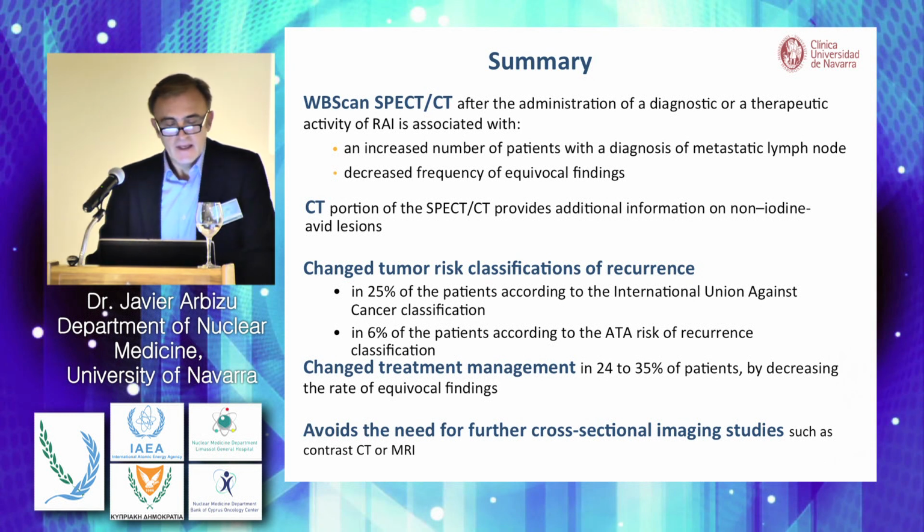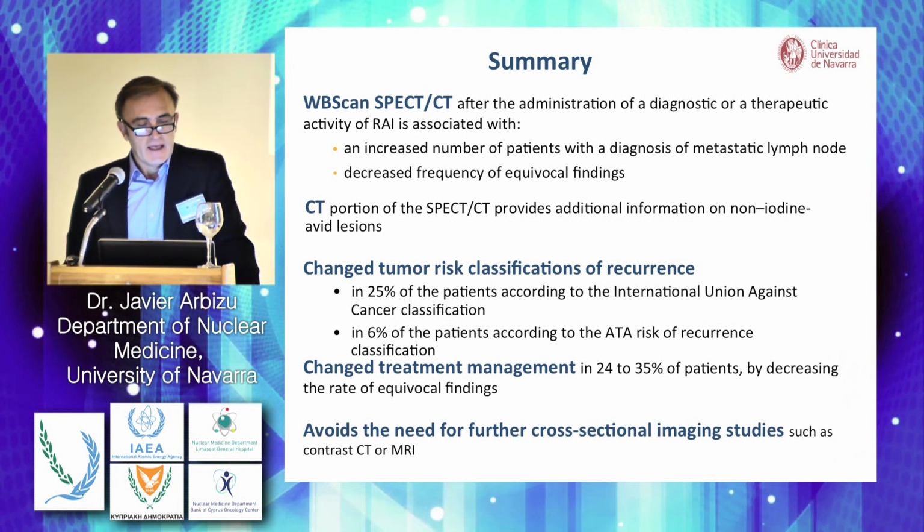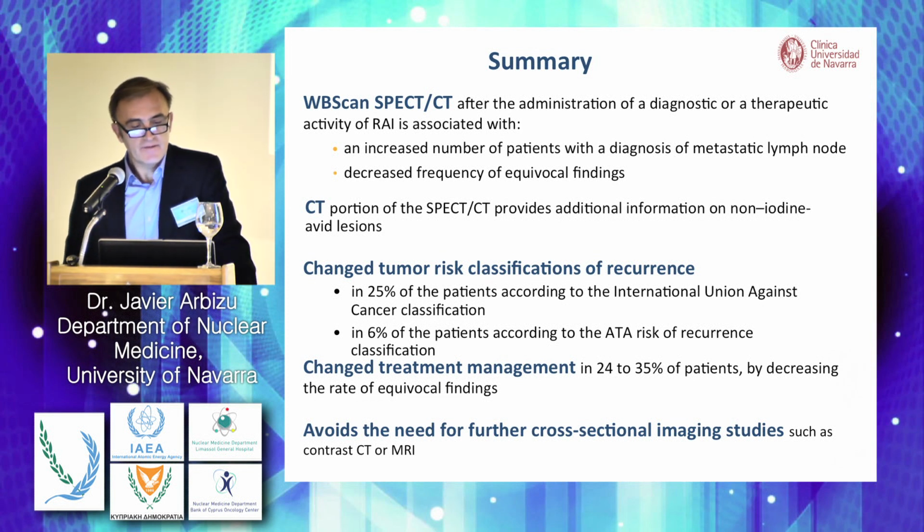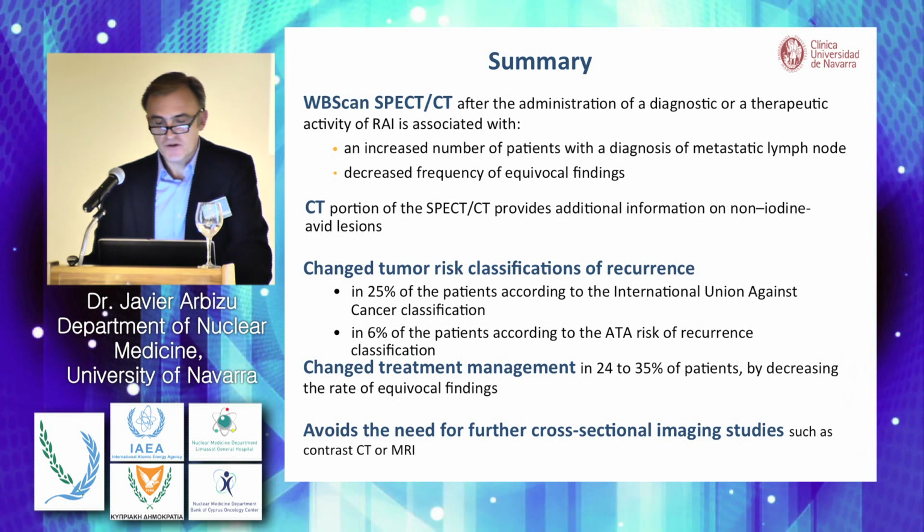So in summary, I would say that whole body scan SPECT, after the administration of diagnostic or therapeutic activity, depending on the follow-up of the patient or after the treatment, is associated with an increased number of patients with a diagnosis of metastatic lymph node and decreases the frequency of equivocal findings. The CT portion of the SPECT by itself provides additional information on non-iodine-avid lesions.